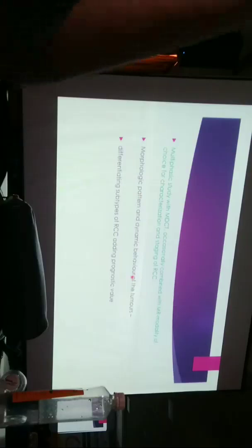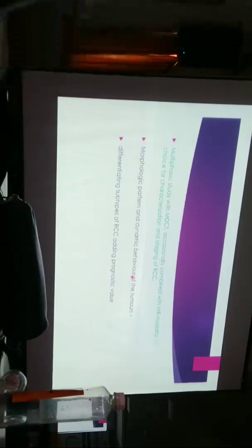So for the staging of RCC, generally a multiphasic CT with MR modality may be useful for characterization and staging.